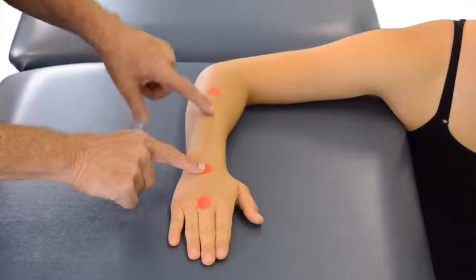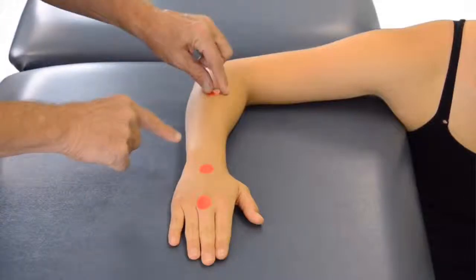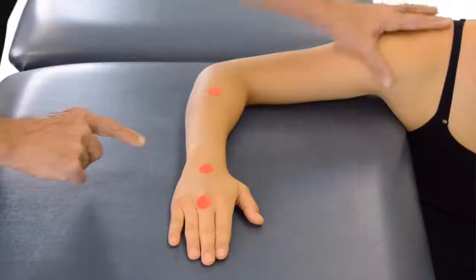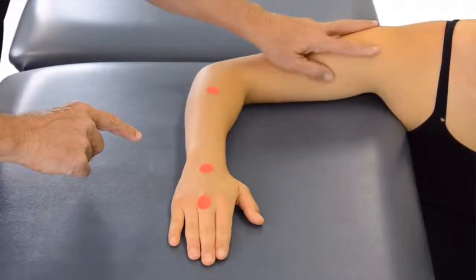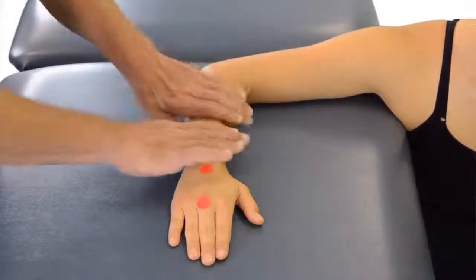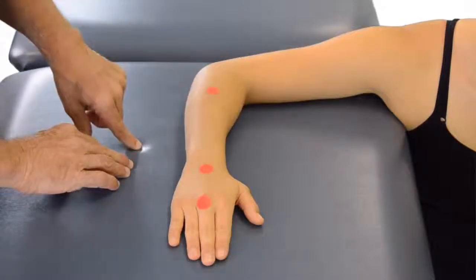Our stationary arm is going to be bisecting the forearm. Because we do not have a landmark and just are looking at a bisection, it is important to have a consistent position of 80 to 90 degrees of abduction of the shoulder and 90 degrees of flexion at the elbow. This puts the forearm in a consistent neutral position with which to establish that stationary arm.